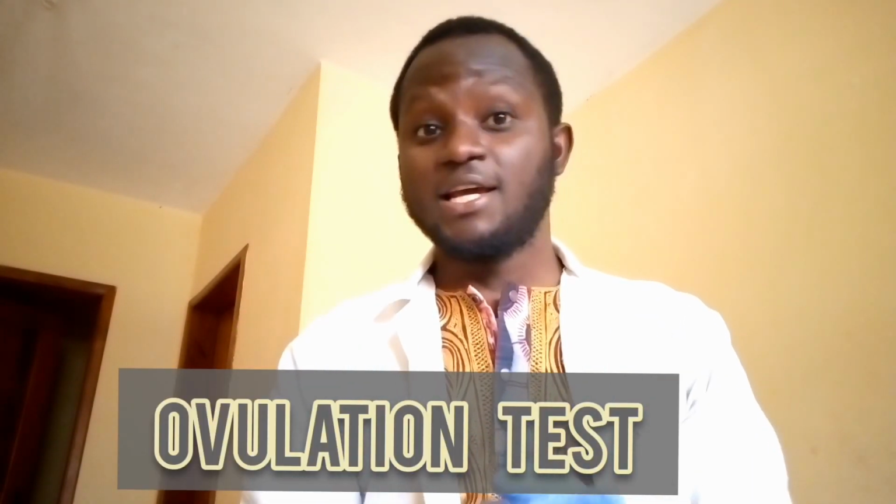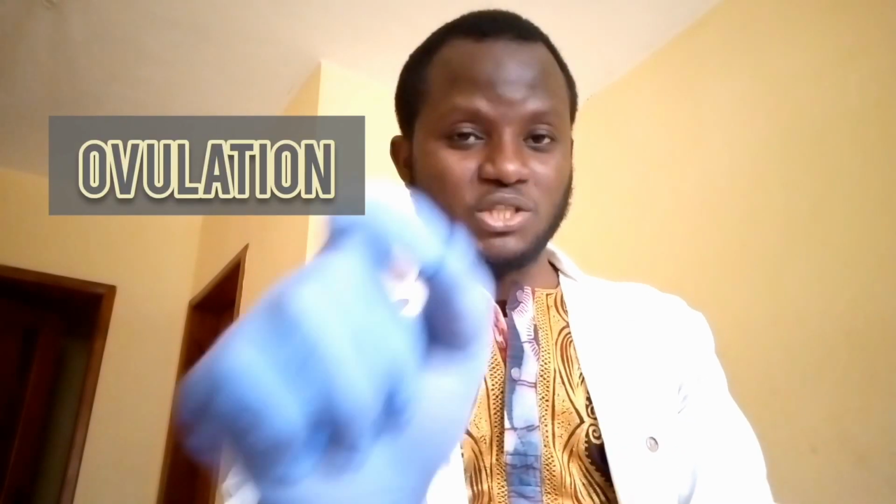As a lady trying to conceive, you must have heard about ovulation test. Now, what is ovulation test? This is a test that will help guide you to know exactly when ovulation is around. But one of the most difficult things is the interpretation of this test, because it looks like a pregnancy test, whereas it's different.